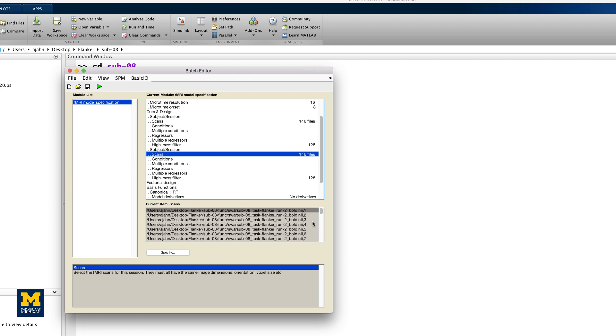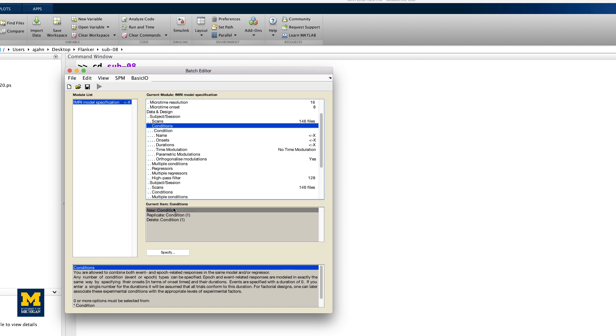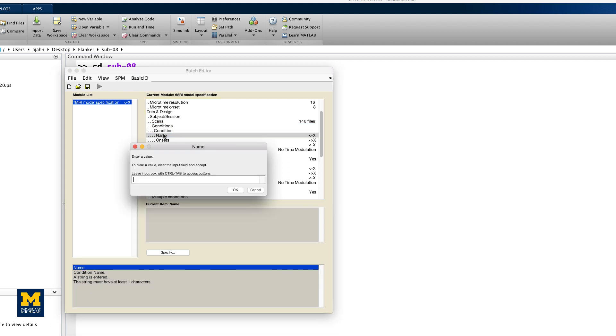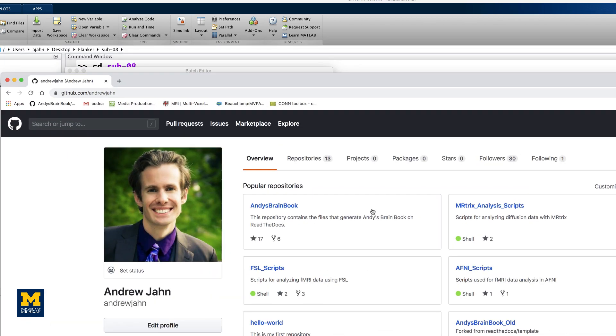Go back to the field for the first session. There are two conditions in the experiment and both conditions occur in each run. Click on Conditions and then New Condition twice to create two new condition fields. For the first condition, double-click on Name and type Inc for Incongruent. We will now need the onset times for each occurrence of the Incongruent condition.